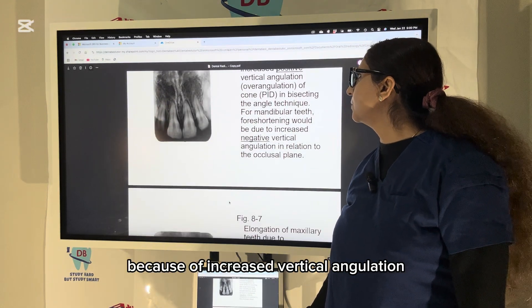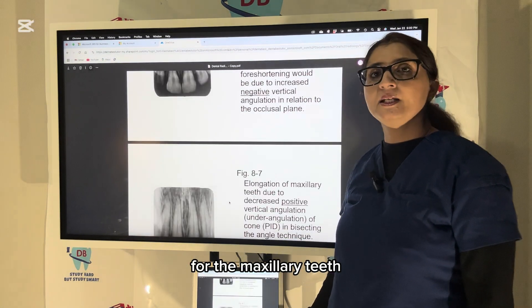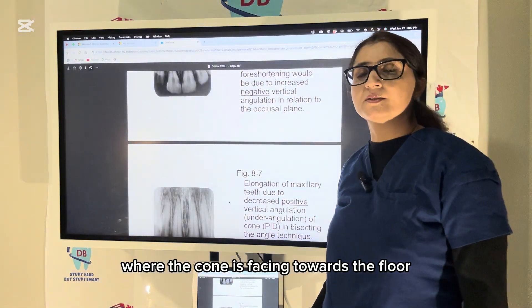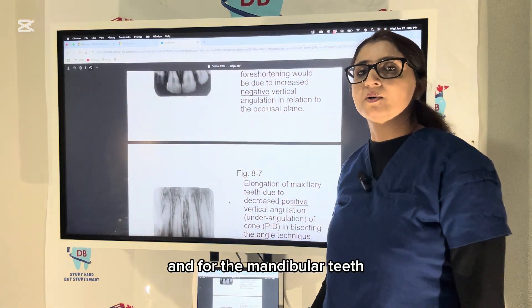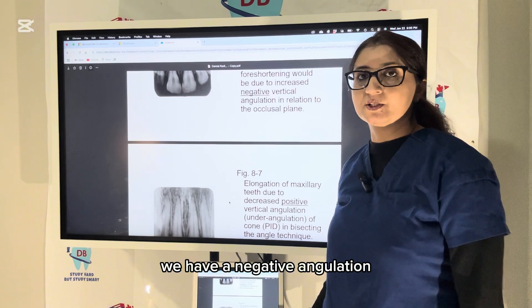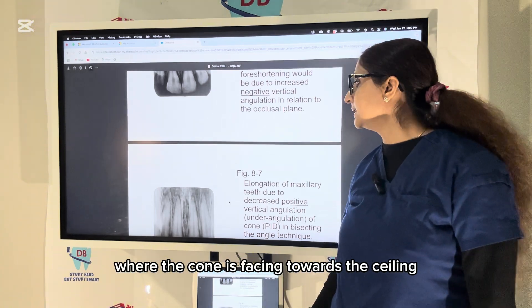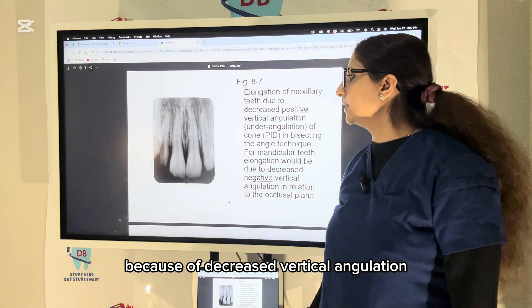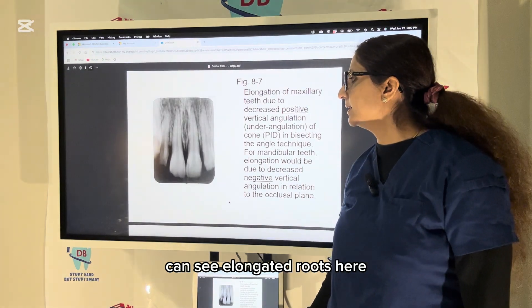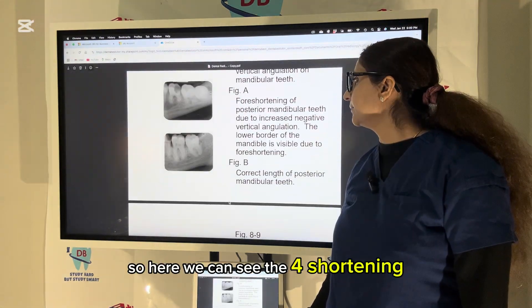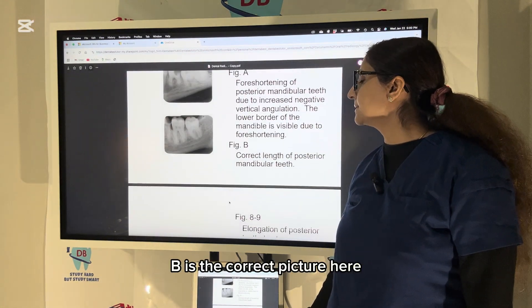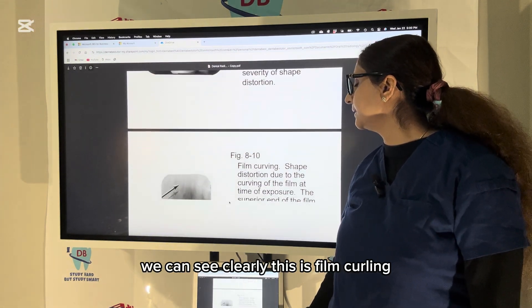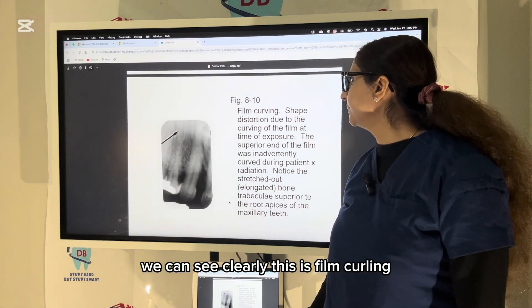For the maxillary teeth we have a positive angulation where the cone faces toward the floor, and for the mandibular teeth we have a negative angulation where the cone faces toward the ceiling. This is elongation due to decreased vertical angulation — you can see elongated roots. Here foreshortening is shown; B is the correct picture. This again shows elongation clearly.